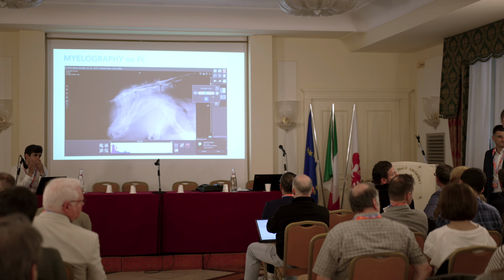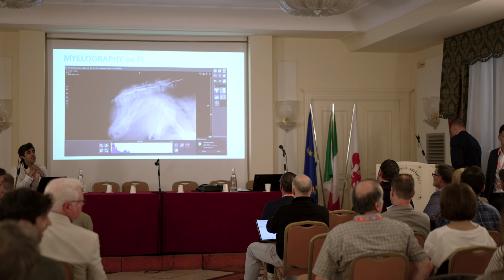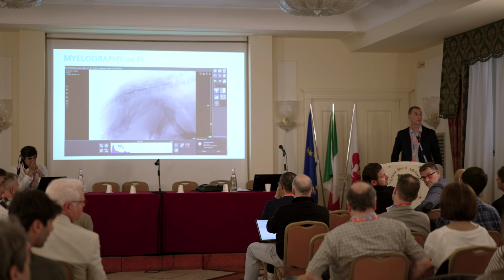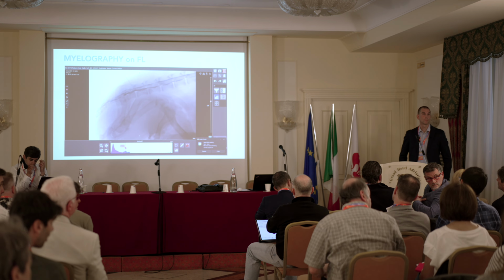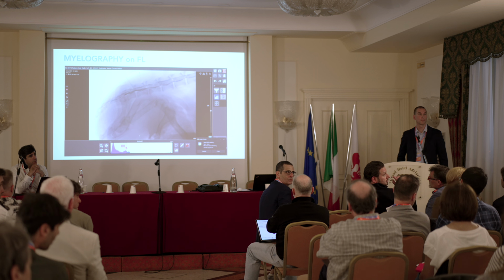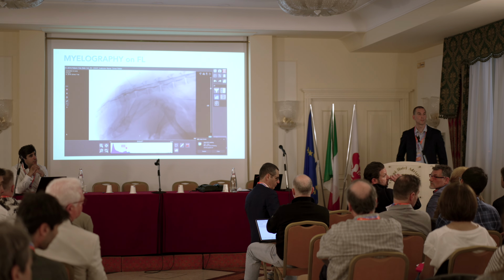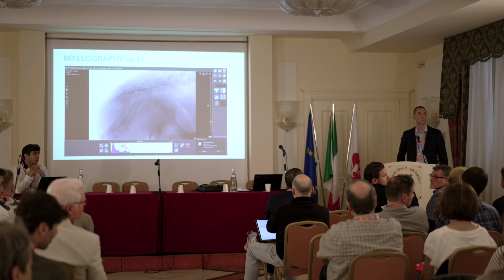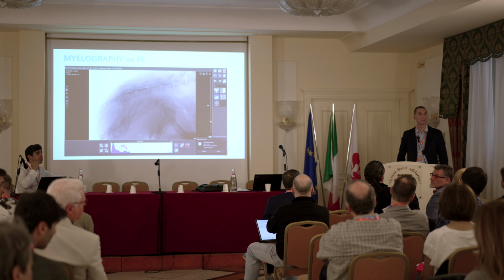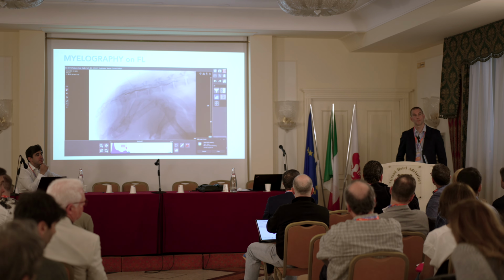Well, at the moment there's, let's say, 50% of spinal cases that are brachycephalic dogs, right? And in my opinion, the brachycephalics are very hard to hit the point inside the spinal tap, or I mean cerebrospinal tap and the lumbar one. Do you have any comment on that? Just if they are more difficult or not?